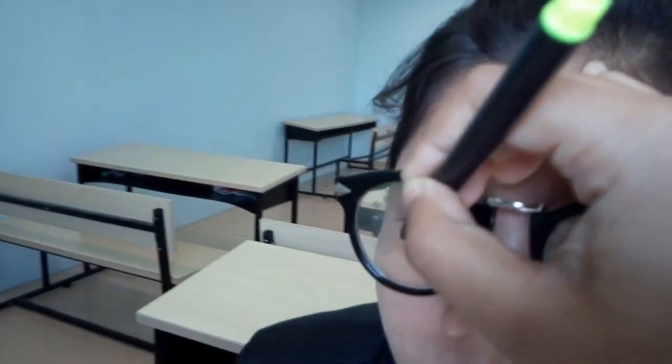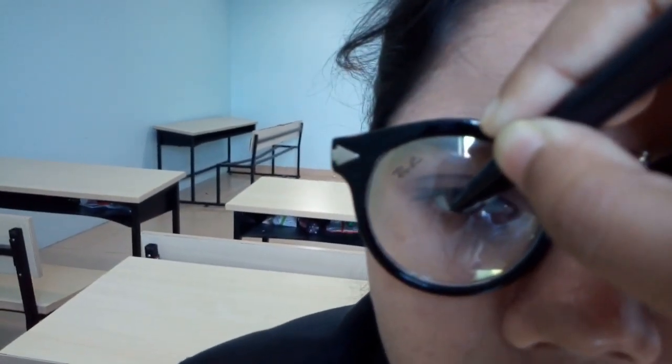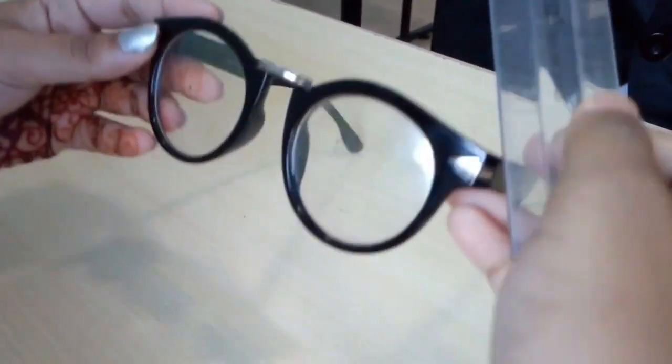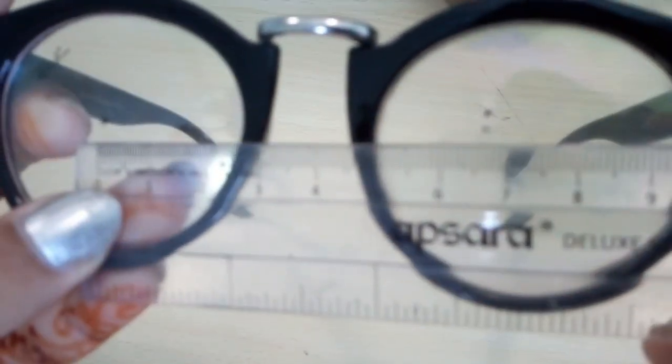Again, the examiner closes her right eye and asks the patient to look at her left eye, and likewise she marks the pupillary center on the frame. Now, with the help of a regular ruler, the examiner measures the distance between the two marked points.